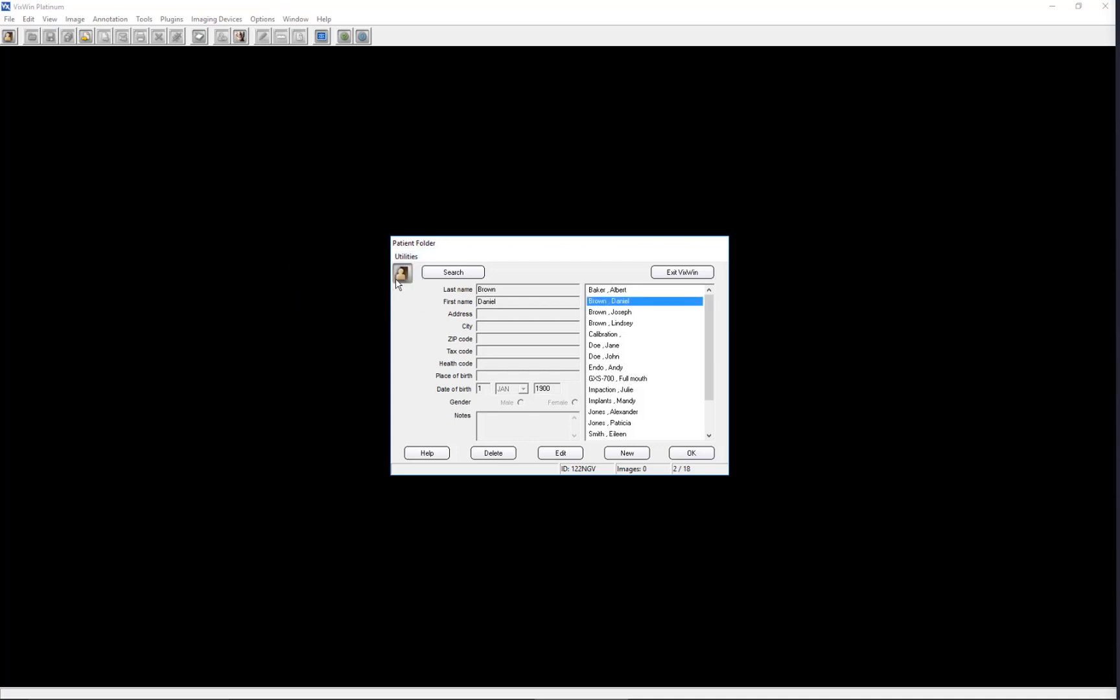The remaining Utilities function pertains to patient archiving. At present time, this feature is unavailable, but is expected to be activated in a future release of the software.